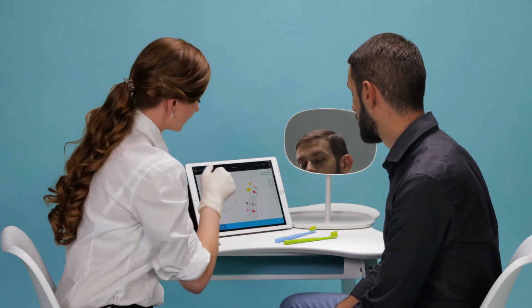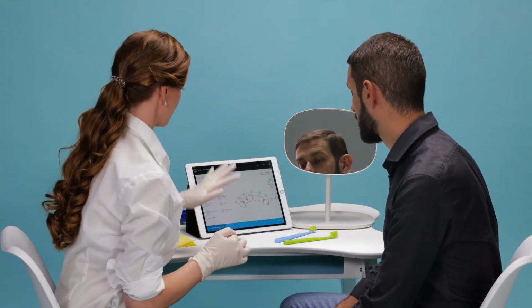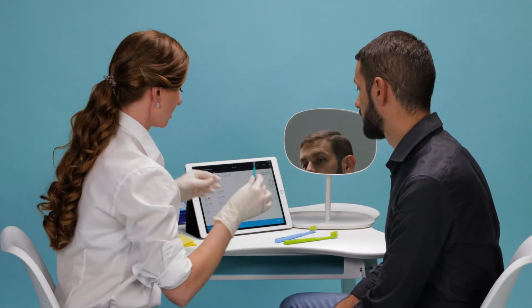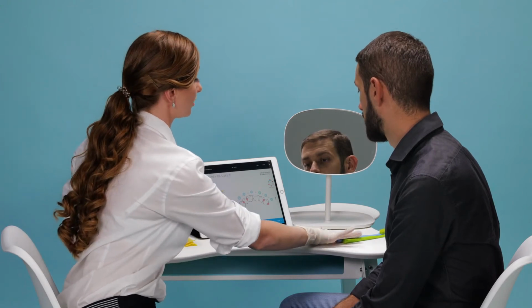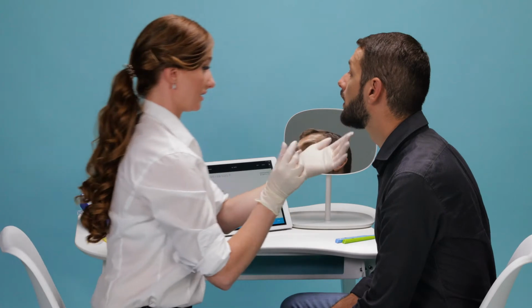We continue on to the upper anterior sextant, where previously Edward was recommended the prime turquoise. I check the size whilst Edward is watching the technique I use for this brush in this area.